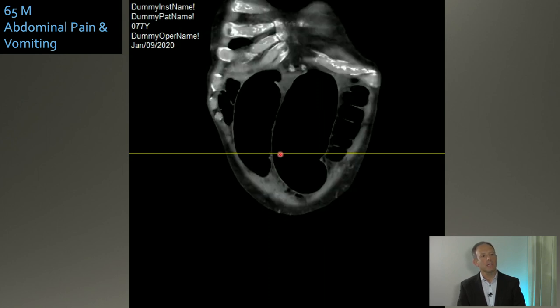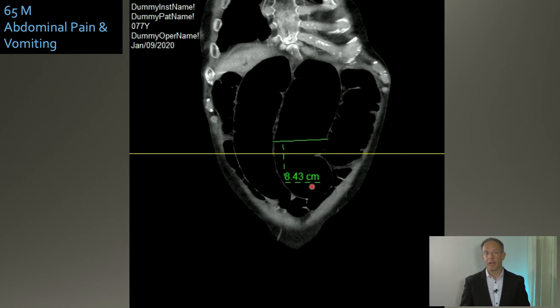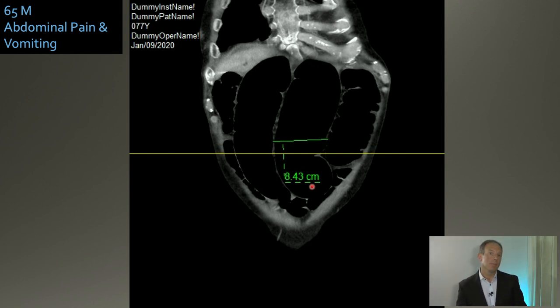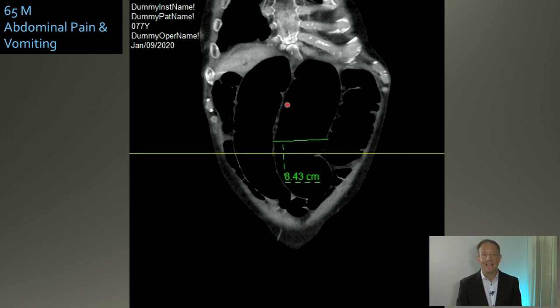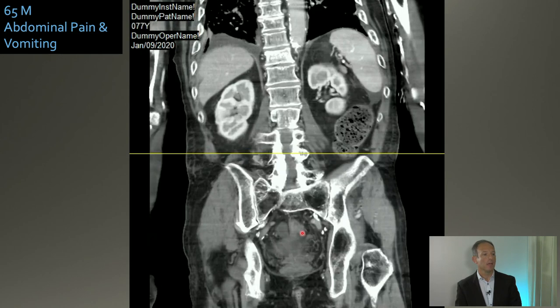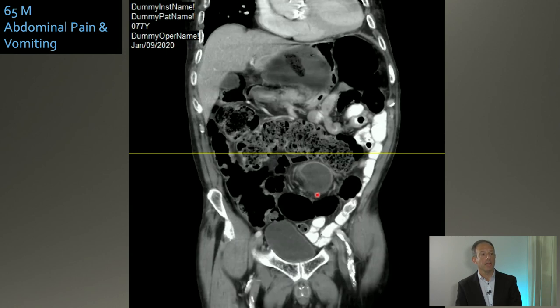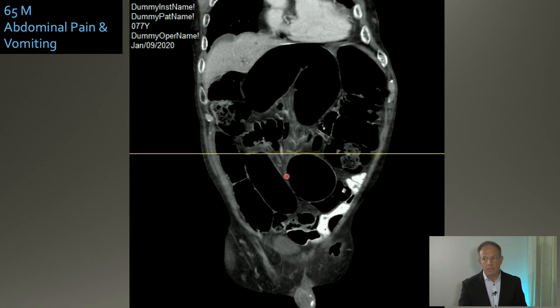Looking at the bowel in the coronal view, it measures out at about eight and a half centimeters. I use the 3-6-9 rule: three centimeters is the upper limit of normal for small bowel, six centimeters for large bowel, and nine centimeters for the cecum or sigmoid. In this case, you've got large bowel that's two and a half centimeters bigger than it should be. You can tell it's large bowel because you can see the haustra come into view in the coronal plane. As you come from anterior to posterior and follow the colon cranially — there's your choke point: very small caliber, then large caliber, then these giant loops. This is an example of a sigmoid volvulus on CT scan.